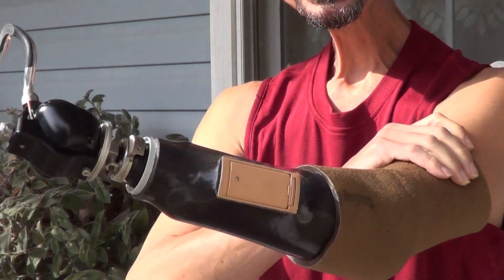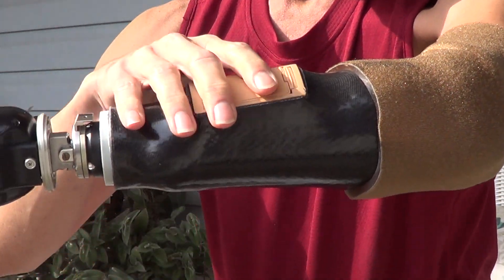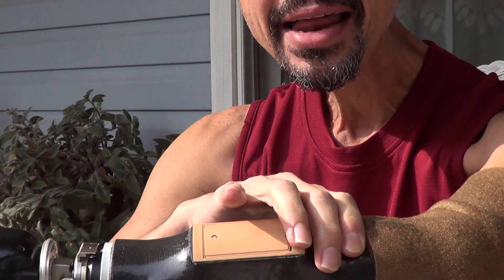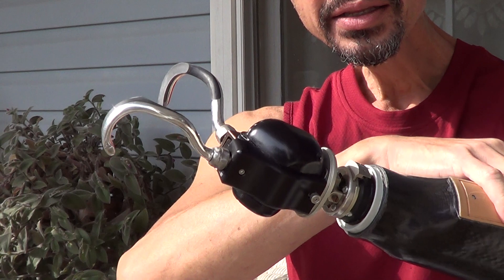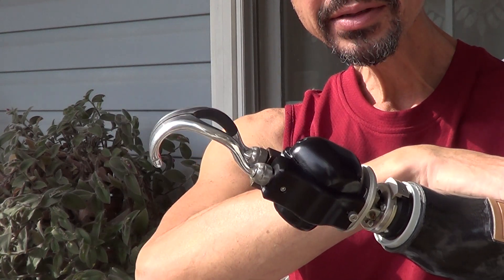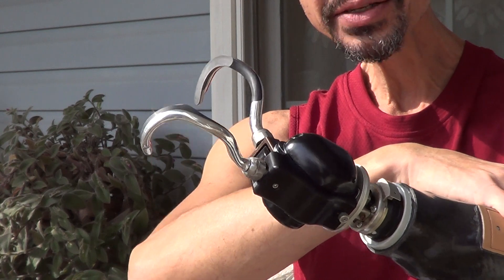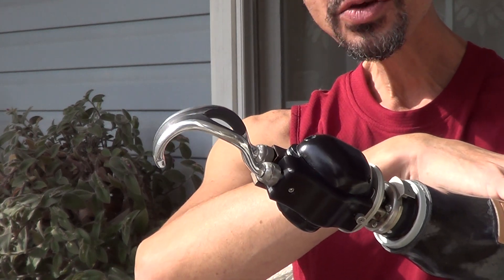I'll explain some things about it. This is the battery pack and it has sensors on the inside that I fire with my muscles on the inside of the prosthesis. As you can see, I'm firing one muscle now, firing the other one to close it.